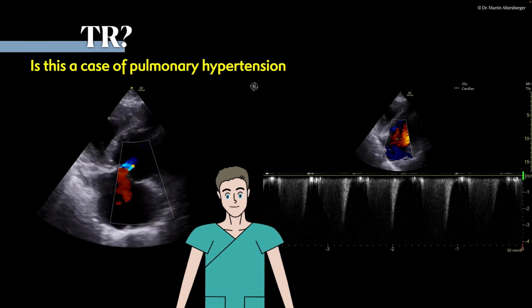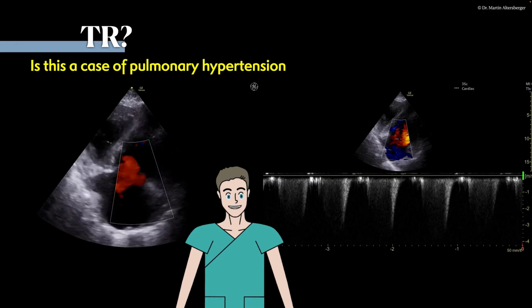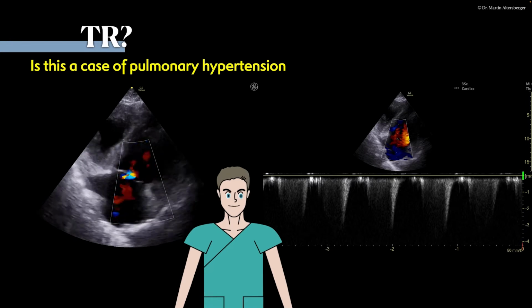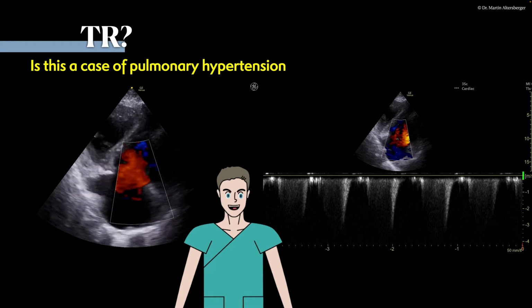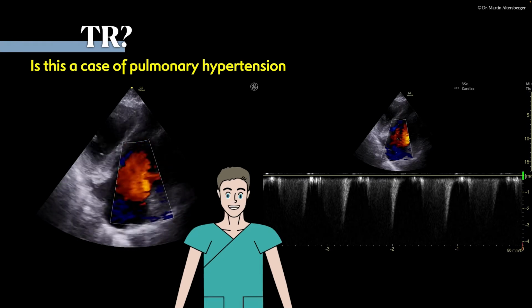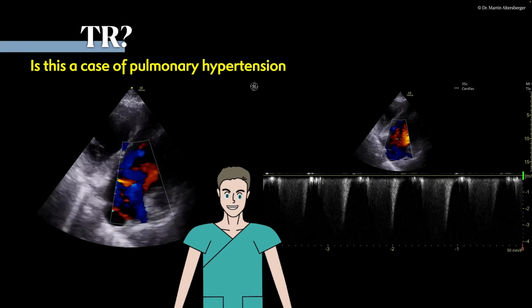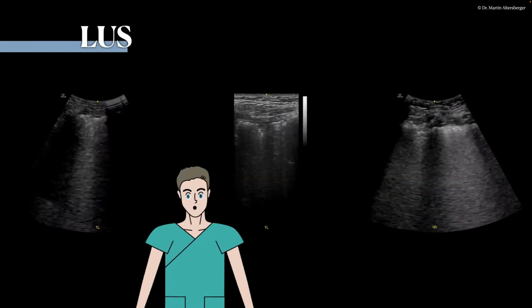It is very important to also visualize, of course, tricuspid regurgitation, because if you have a massive or torrential tricuspid regurgitation, you also have a volume problem, so volume overload of the right ventricle. So it's very important to see and differentiate: is this a valvular heart problem or is it truly a pressure problem, as we assume in this case.